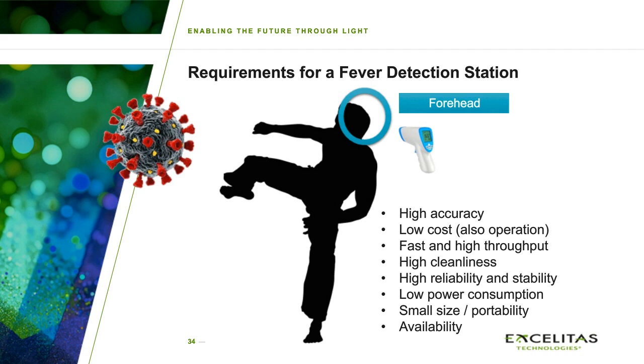concern. You may be able to find a supplier on the market who gives you sensors, you have samples, you build something up, at the end you try to order it, and it takes several weeks until you get the first sensor. So really at the very beginning, you should be sure that the supplier which you have chosen can deliver actually your demand.